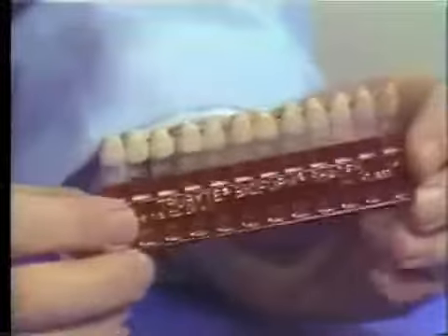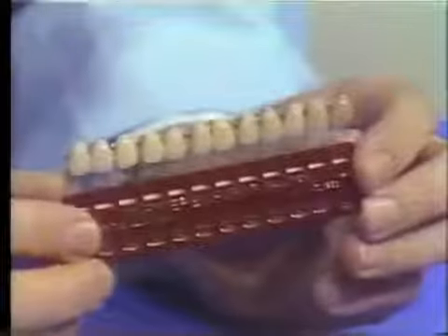If you're going to use a vacuum-fired porcelain facing, then you use the same bioform shade guide that we utilized in the case of the long pin facing. If you're going to use one of the resin types of facing, then you use the biotone shade guide to select the particular facing.